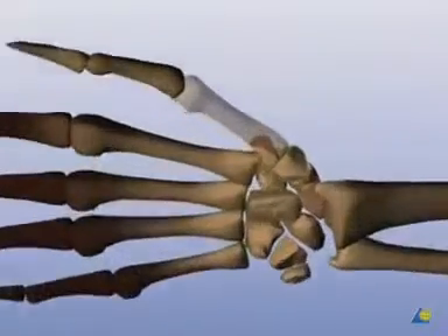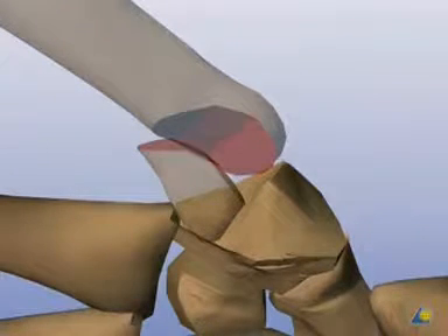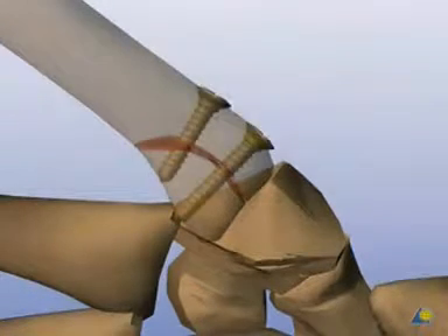This is a typical Bennett fracture with a large ulnar palmar fragment. By opening the fracture, the involvement of the joint becomes clearly visible. The fracture is to be repaired with two lag screws to make it exercise stable.